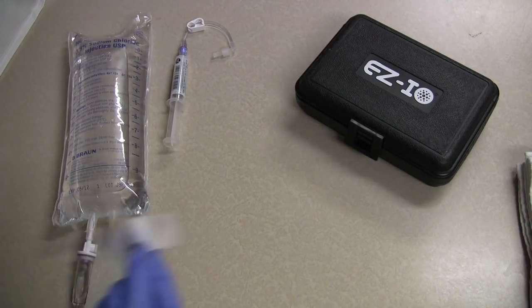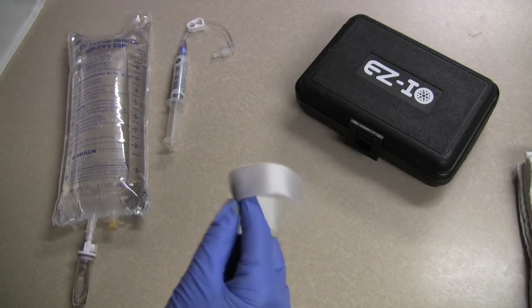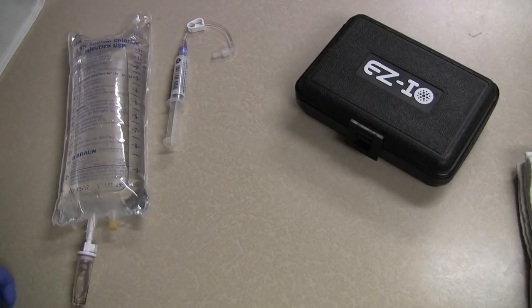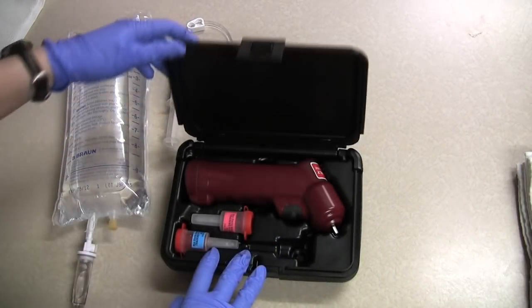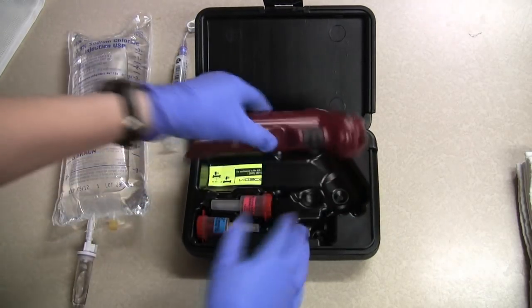I have torn a piece of tape ready for when I secure the IO, and I want to go ahead and check the drill, make sure the batteries are working, and I'll pick the right needle.